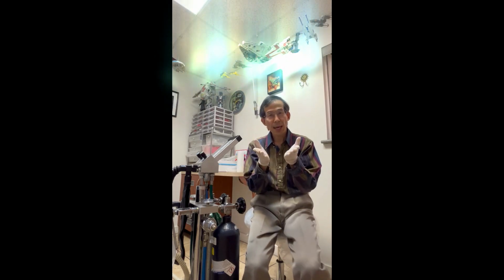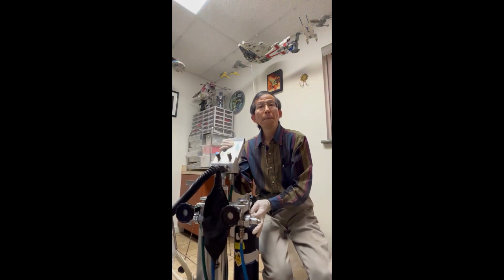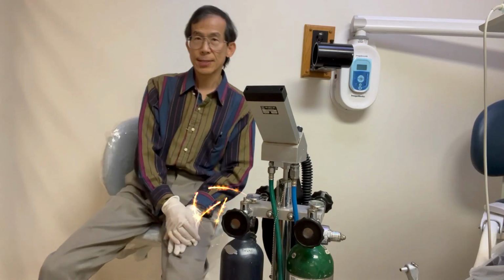In this video, I would like to show you and your assistant how to operate a portable or mobile unit of nitrous oxide used in your dental office. Typically, a mobile or portable nitrous oxide unit has the following features.